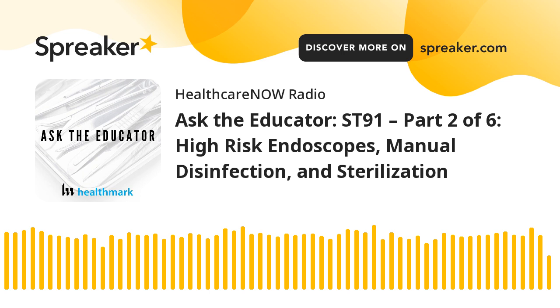But if that is not possible, meaning not feasible, not that we don't want to or we don't want to send it to central sterile because then it's taken out of our hands and put in the hands of another department, but if it's not physically possible, then we resort to high-level disinfection. We've come to just accept high-level disinfection as the standard of care over the years, but we really do want to try to move toward transitioning to sterilization. So as Kevin said earlier, this might be one of those options.